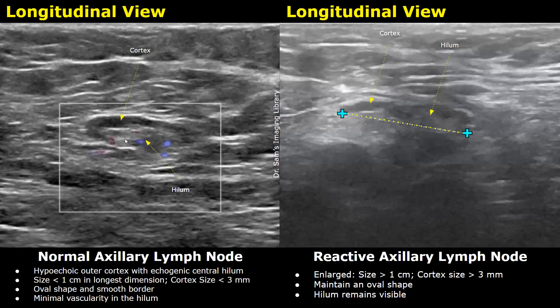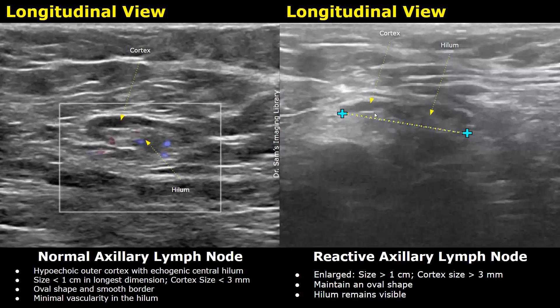A reactive lymph node is seen in association with an infection, inflammation, or autoimmune disease — it is not related to any cancer. A reactive lymph node is usually enlarged, measuring greater than one centimeter, and the cortex can be more than three millimeters. It will maintain its oval shape and the hilum will also be visible. If we see the hilum and oval shape is maintained, we can say it is a reactive lymph node.